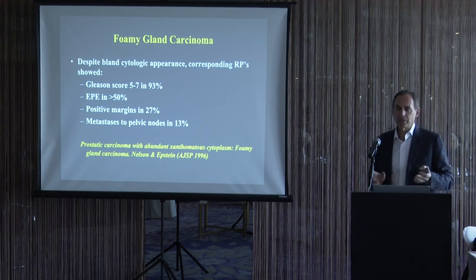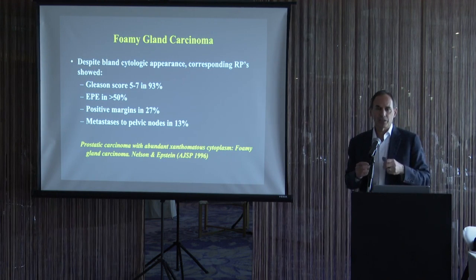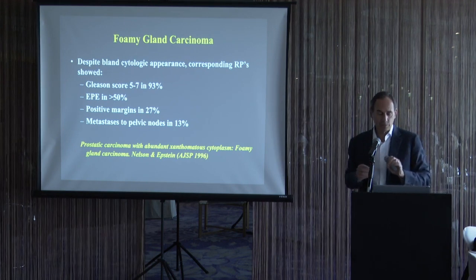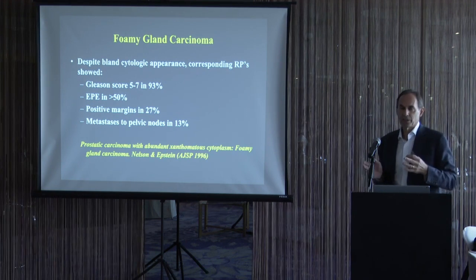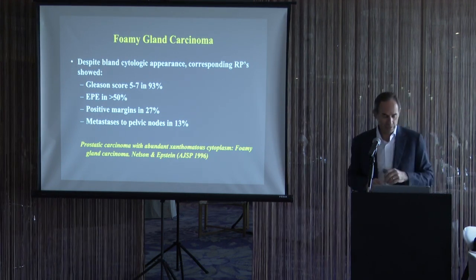Foamy gland cancer resembles benign glands not so much on the architecture, but the cytology. Foamy gland cancer has very bland cytology. The nuclei do not have prominent nucleoli. As I'll talk about in grading, foamy gland cancer can be Gleason pattern 3, pattern 4, or pattern 5.